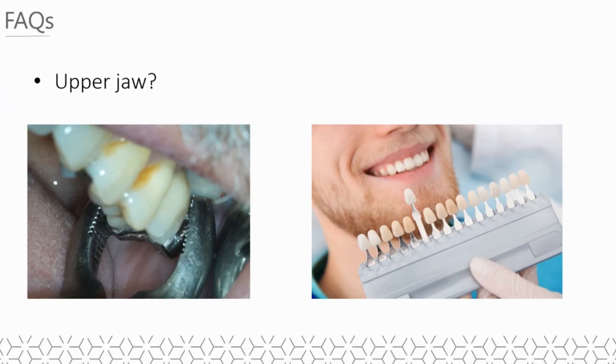And last but not least, the more you do something, the better you become at it. This is entirely true for intraosseous anesthesia. Those who use it in first intention, whenever and wherever they can, are the ones who use it the best and get the most satisfaction and return on investment.